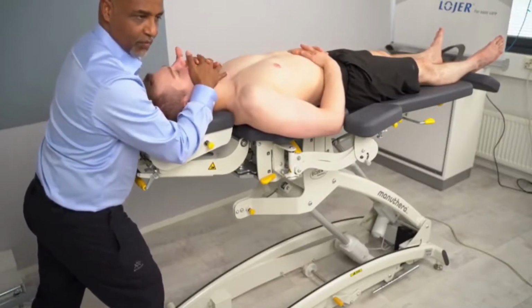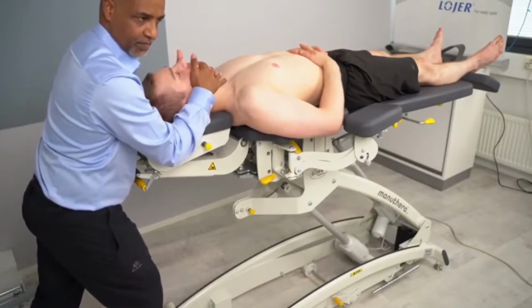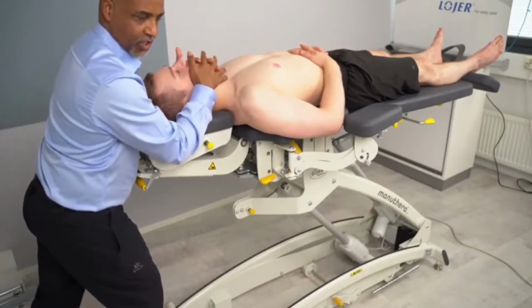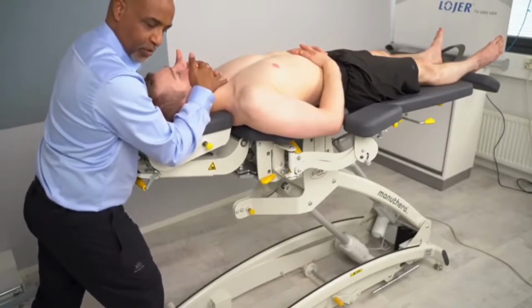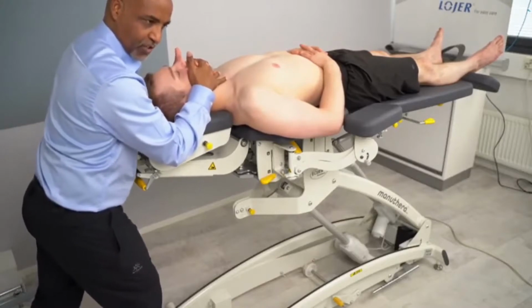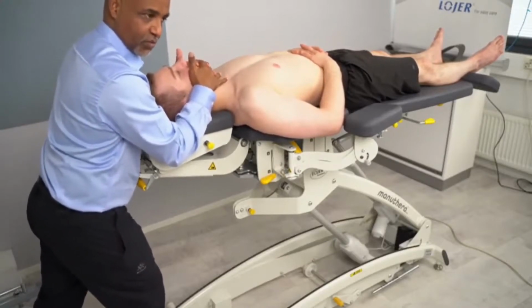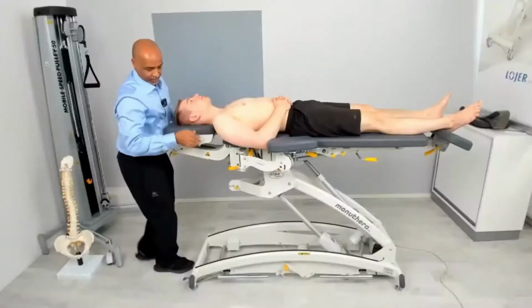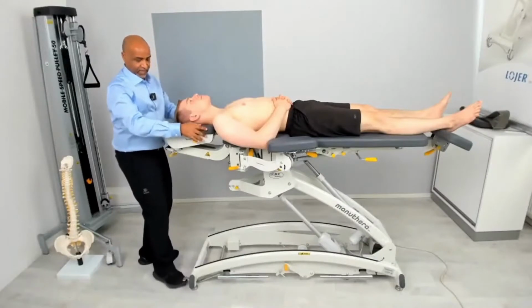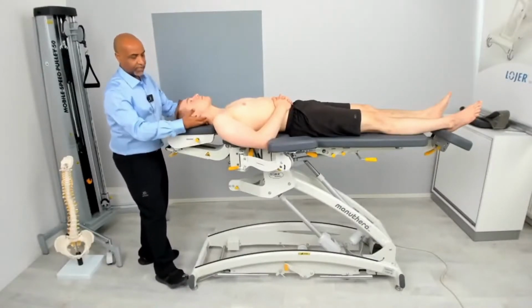It is very helpful when somebody has a herniation of the discs, and it releases the tension on the ganglia of the nerve root, which supports the healing process and also removes the excess fluid in the facet joint which is causing pain. Once you're done, make sure you lock it back and that there is no issue with the neck.